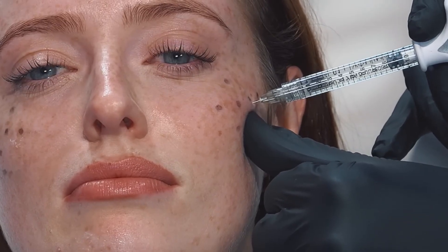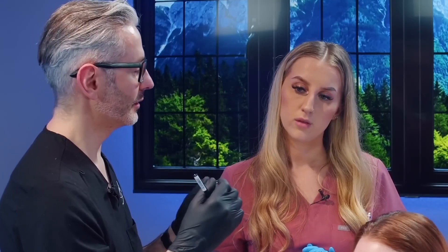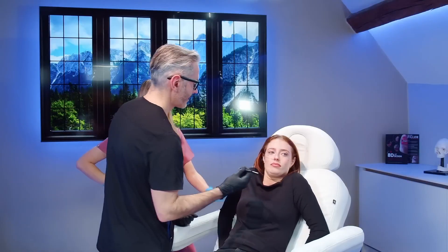Would you inject different amounts on different sides if one had more volume? Sometimes, but usually not. The analogy is a vodka and coke: a single and a double actually look the same because the relative difference is small. If you then add a shot to each - going from a double to a triple - the difference between the two remains X. So you can do the same treatment on both sides and actually decrease asymmetry. That's a little easier than trying to vary the amounts.